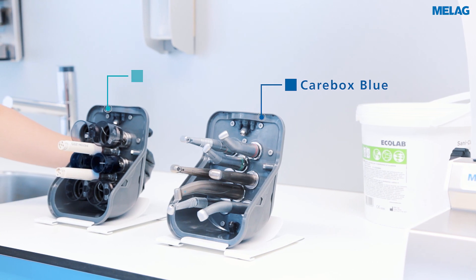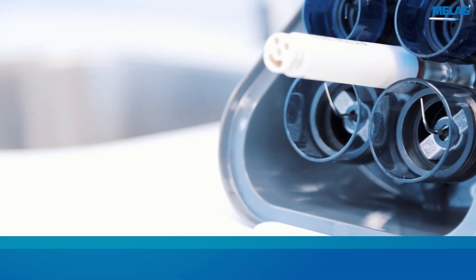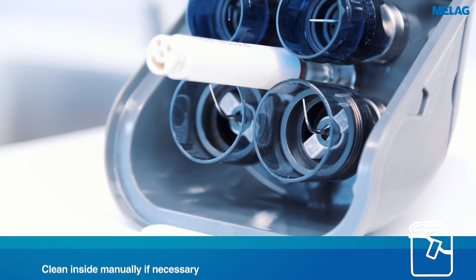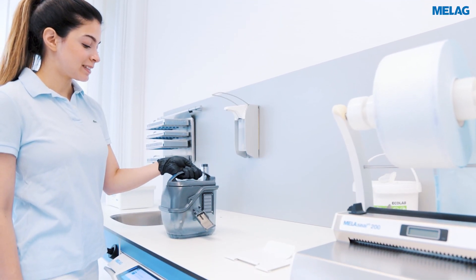Carebox green is used for instruments that do not require oil care. Prepare up to eight prophylaxis hand pieces and ultrasonic scaler tips in Carebox green with a torque wrench. Afterwards, put the lid on the Carebox and leave the caps open.